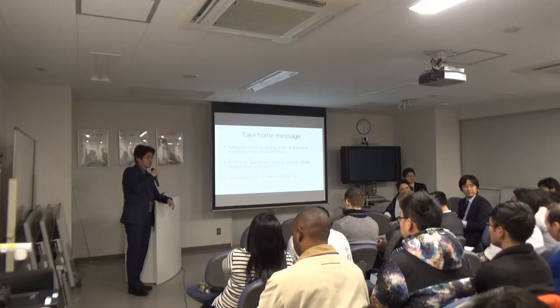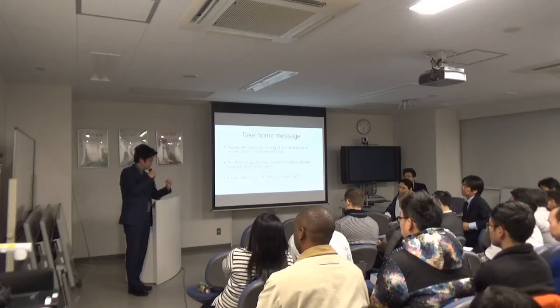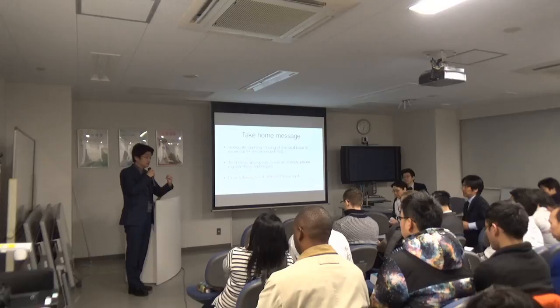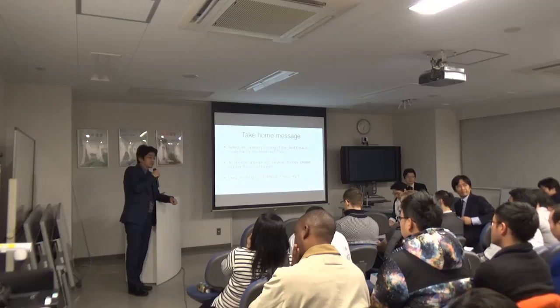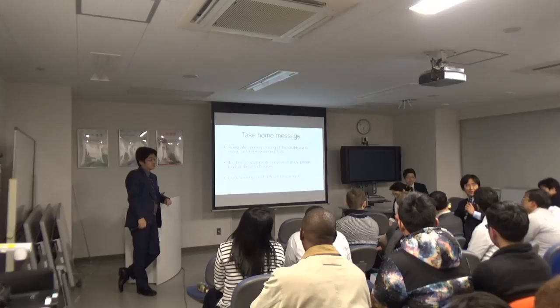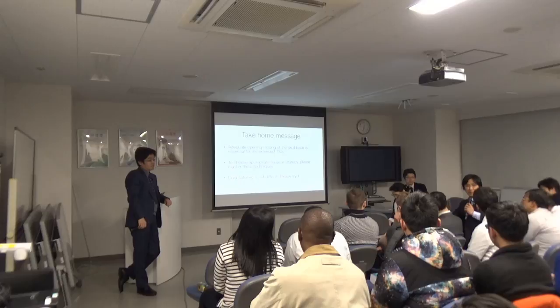How to do it? The ENT surgeon treats the patient. I usually refer the patient to the ENT surgeon, and the ENT surgeon treats the nasal cavity, so it's no problem, I think. I think one nostril or two nostrils is not a big matter. You can use both nostrils. The manipulation is much better. You can avoid the conflict between tools and endoscope. So it's not a big matter.